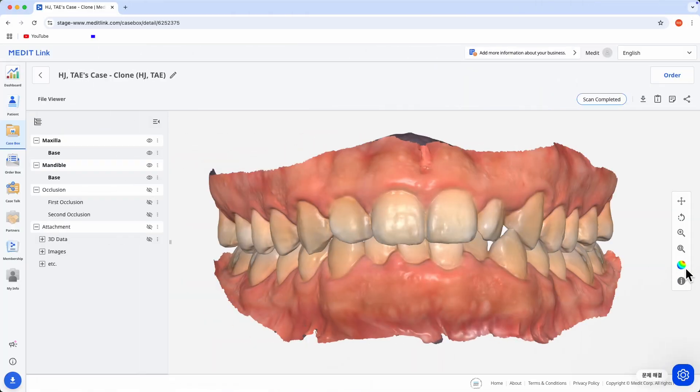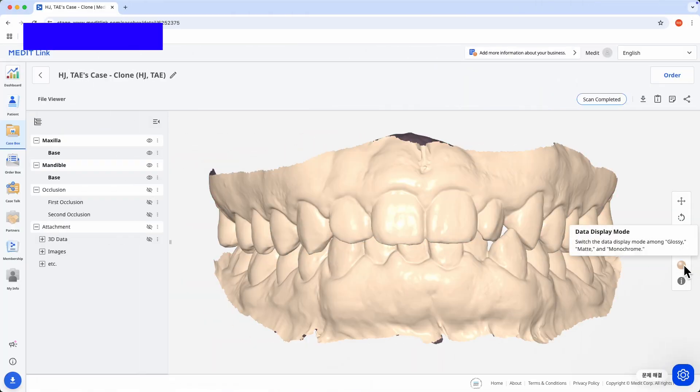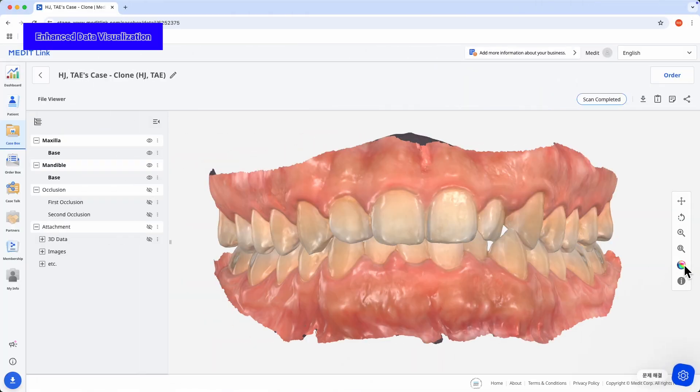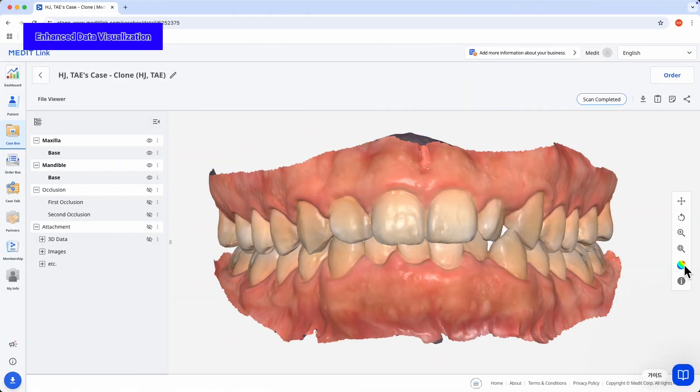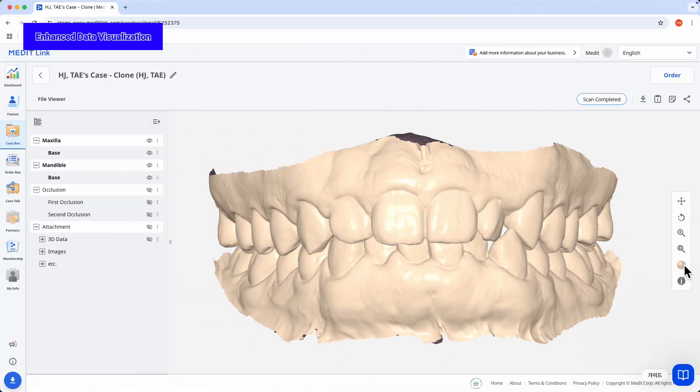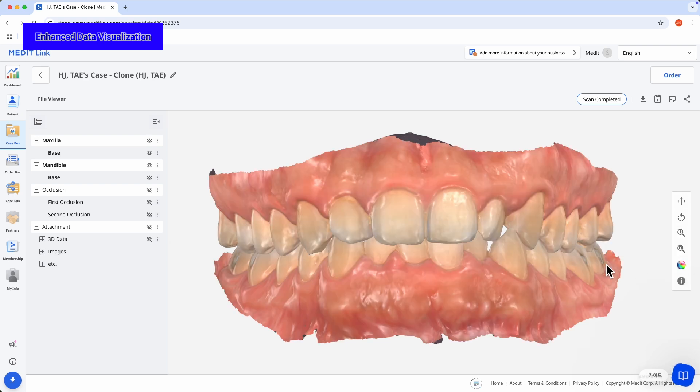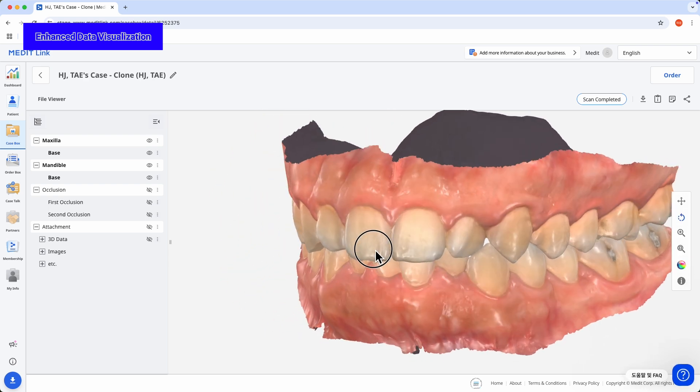On MeditLink Web, you can now use glossy mode to see realistic shine and color. Your scan data will look more vivid than ever.